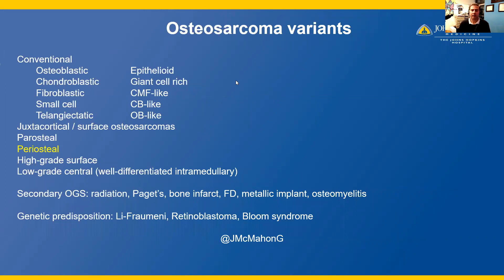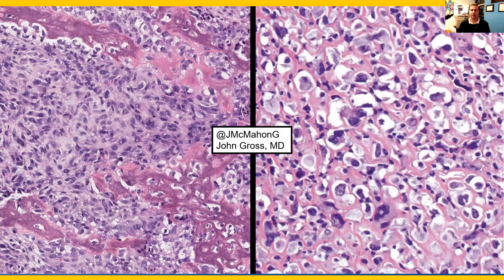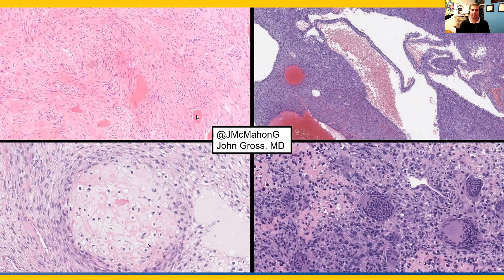It's one of the variants of osteosarcoma, which I'd like to briefly review. The most common variant is conventional osteosarcoma — the osteoblastic type. Here on the left is an intermediate-to-high-power view showing these pleomorphic and anaplastic cells directly producing mineralized osteoid, which is the definition required for an osteosarcoma. On the right at higher power, we again have these pleomorphic cells producing and mineralizing bone matrix. It's quite lace-like and fine bone production — this is an osteoblastic osteosarcoma, the most common subtype.